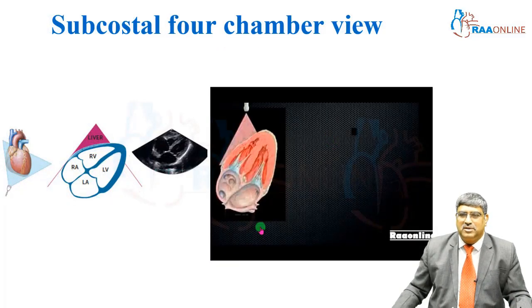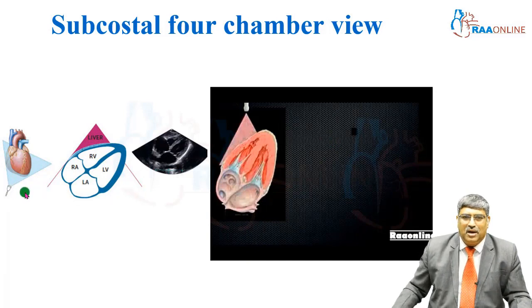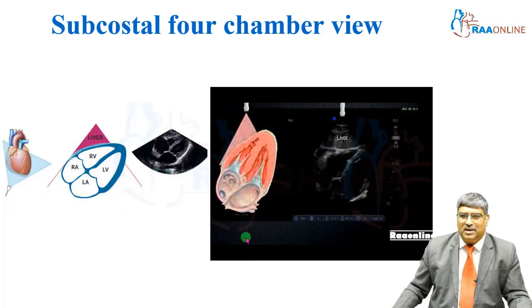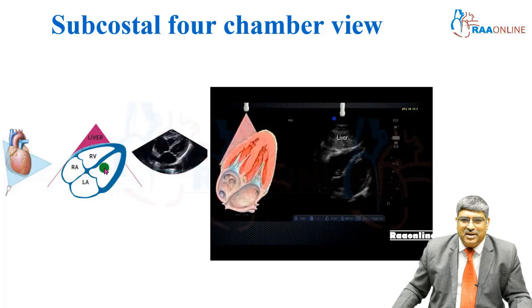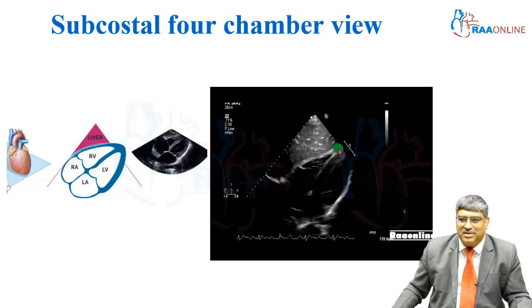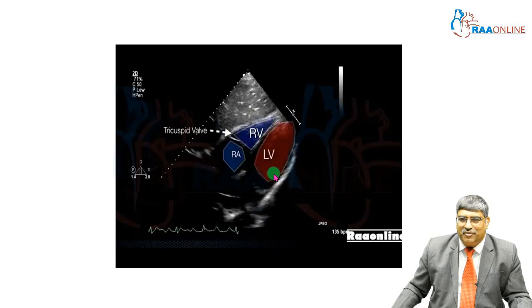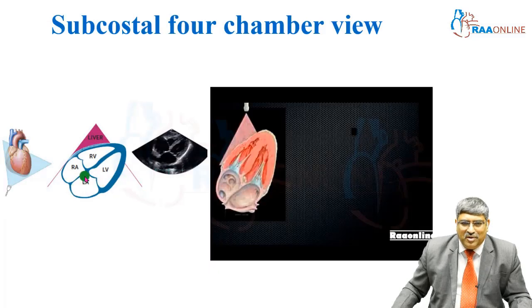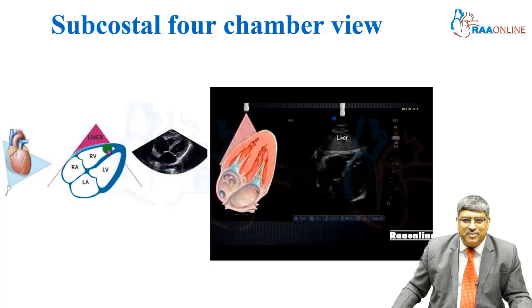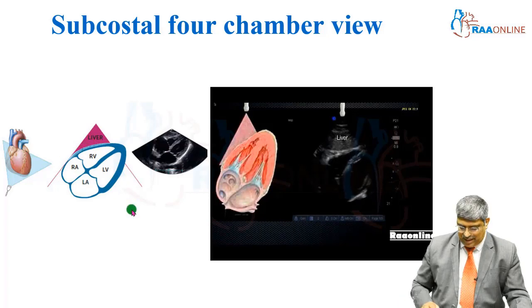Coming to the subcostal view, you place the probe in the subcostal part and you cross the liver to examine the four chambers of the heart. Here you have the right ventricle, right atrium, left atrium, and the left ventricle. You can see the right ventricle, the tricuspid valve, right atrium, left ventricle, and the left atrium. In this view, you can even look at the intra-atrial septum and the intraventricular septum along with the four chambers of the heart.